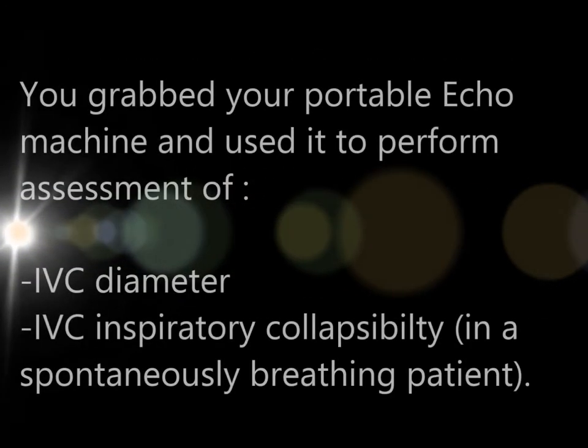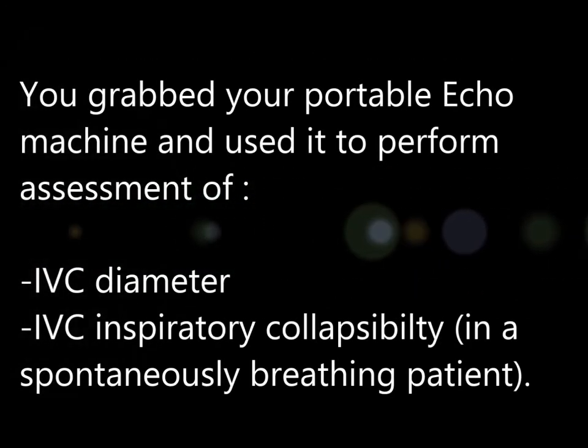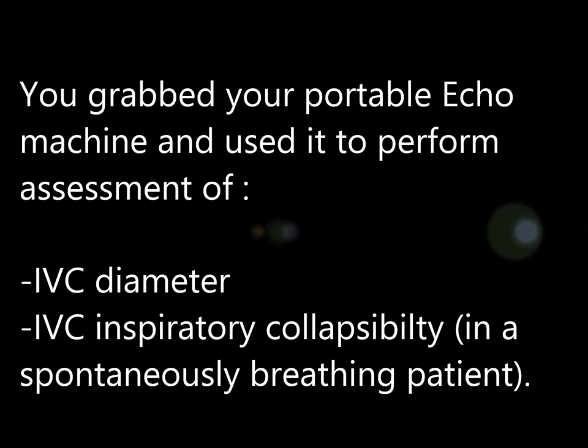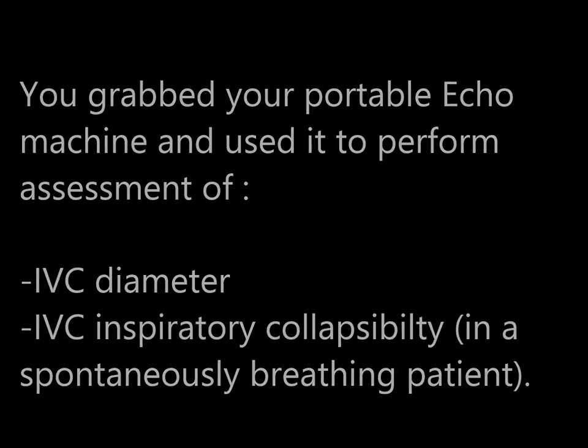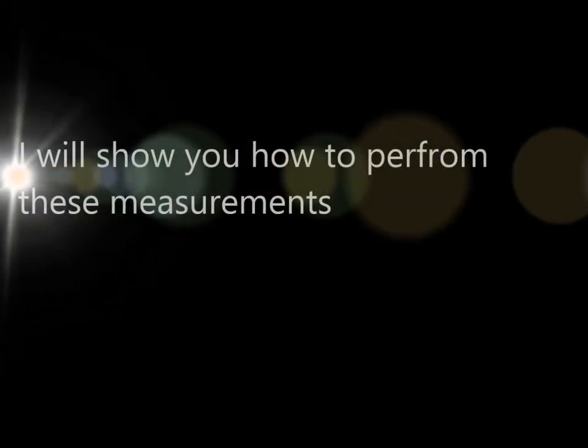You grabbed your bedside echo machine and used it to perform assessment of the IVC diameter and inspiratory collapsibility. Together, these two parameters can be used as markers of the volume status of the patient. Here I will show you how to perform these measurements as part of goal-directed echocardiography.